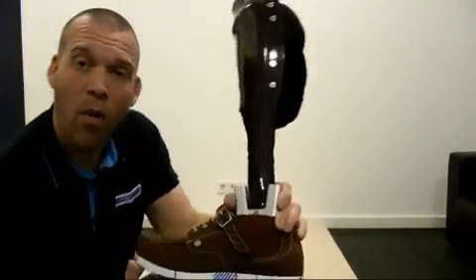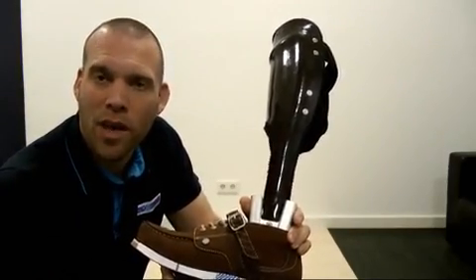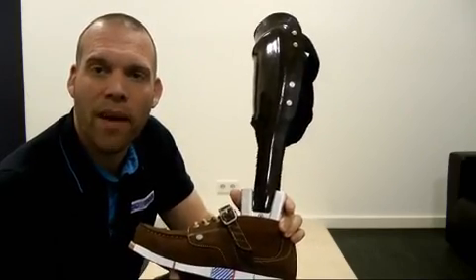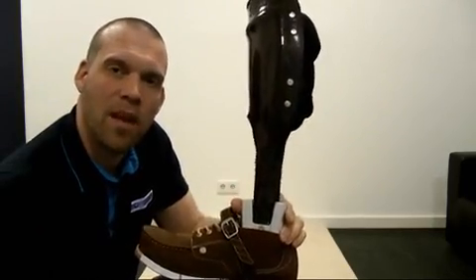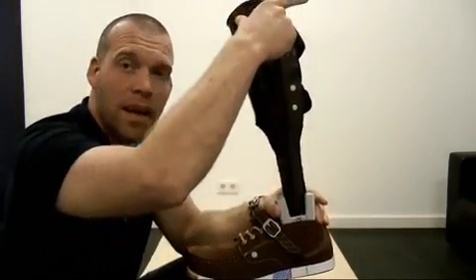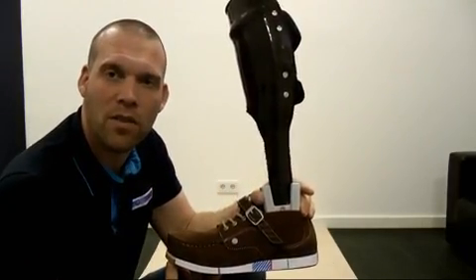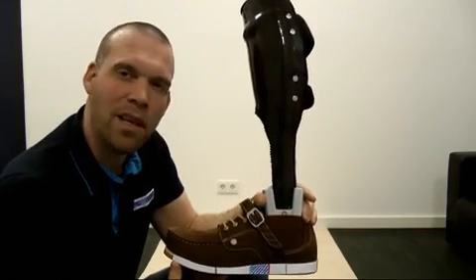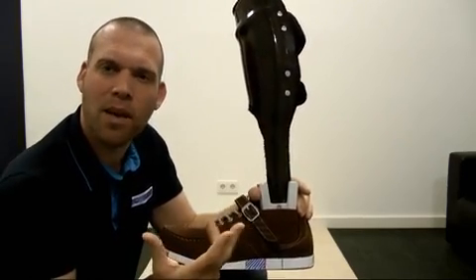The alignment of an orthosis should of course be checked once on the workbench before we go to the patient and check the static alignment. How it works is explained in depth in the online tutorial. We described that the vertical plumb line from the center of gravity through the middle of the AP should fall in the front half of the supportive area. These are all very nice words, but what exactly do they mean? What is hidden in this terminology?